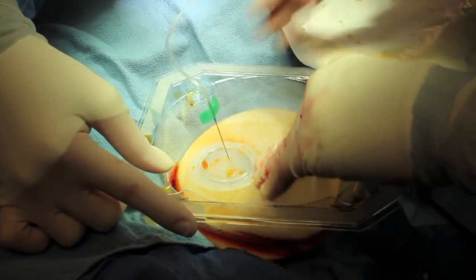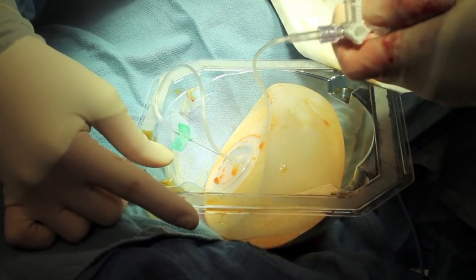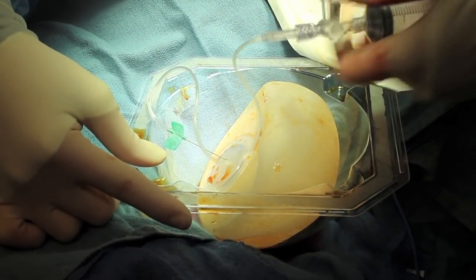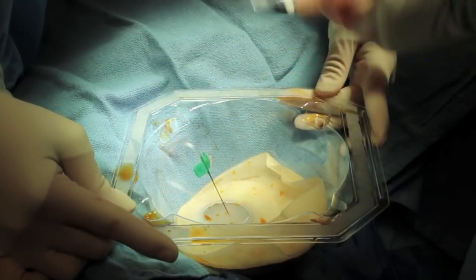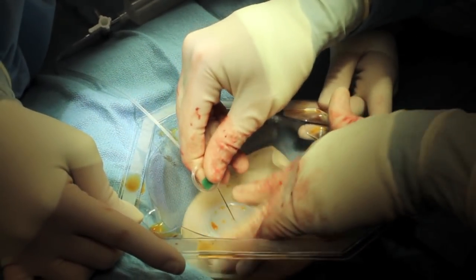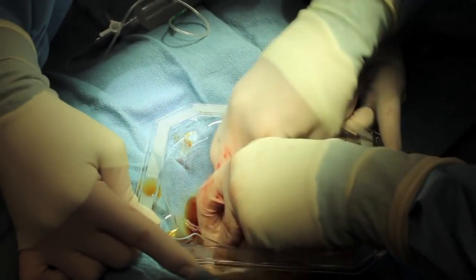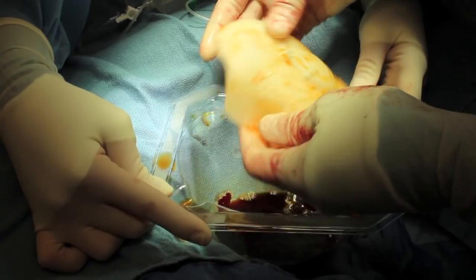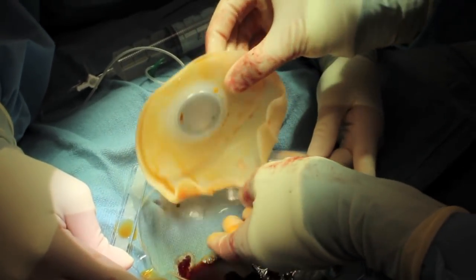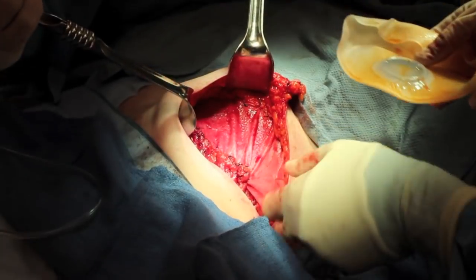This is the tissue expander. We access it with a needle, and you can see this in another video, but we remove the air from the tissue expander, and now all of the air has been removed, and the tissue expander is bathed in an antibiotic solution, and then it's simply rolled up and placed into the body.